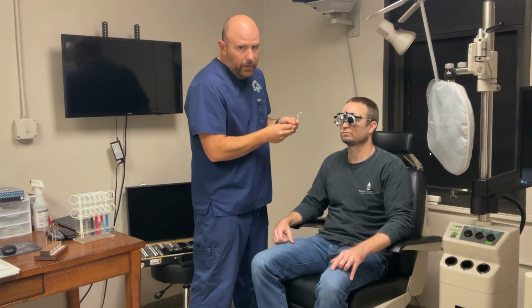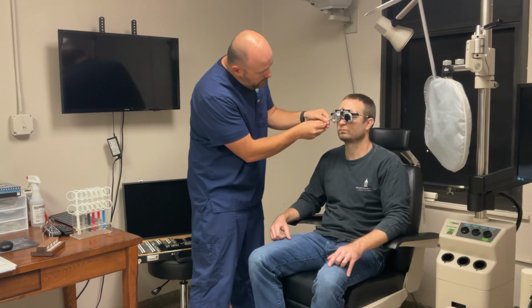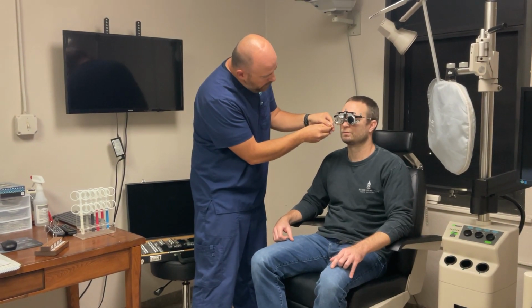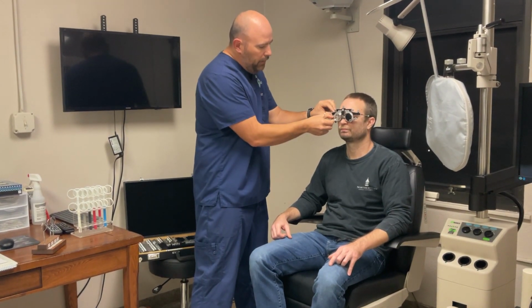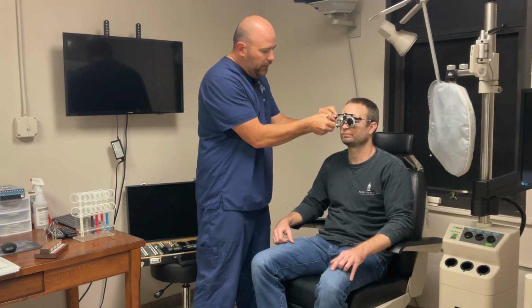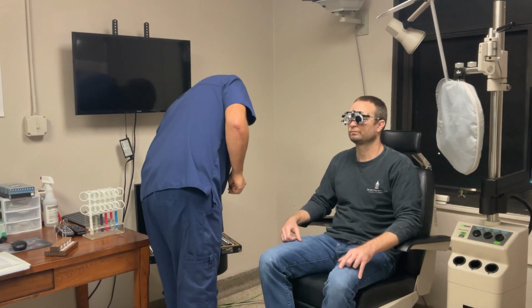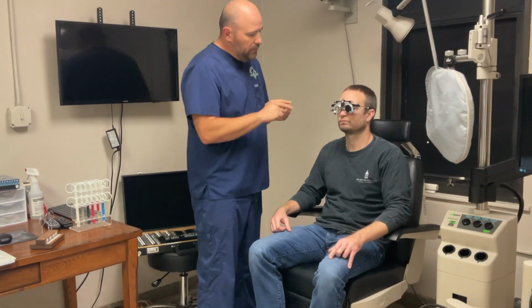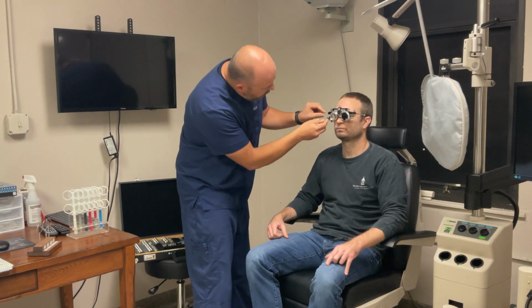Okay, so we're back up to -1.25, and now we're checking the power again. Looking at that C, here's 1, here's 2. 2. All right, so he's taking me back down to the plus. So we're somewhere around a -0.50. The fact that he was finding a spot for a cylindrical axis indicates that he does have some amount of astigmatism there, and we're somewhere around a half a diopter, give or take.